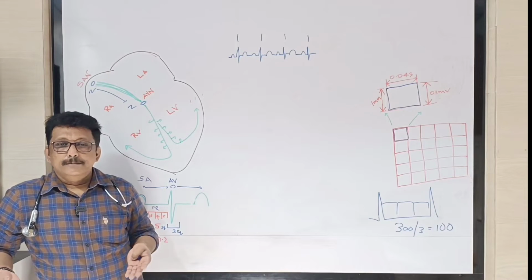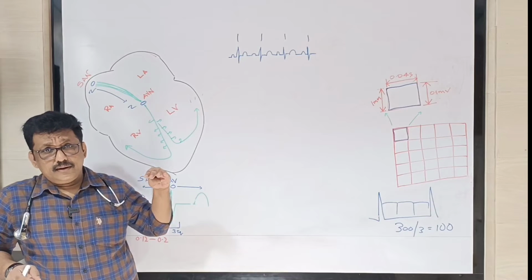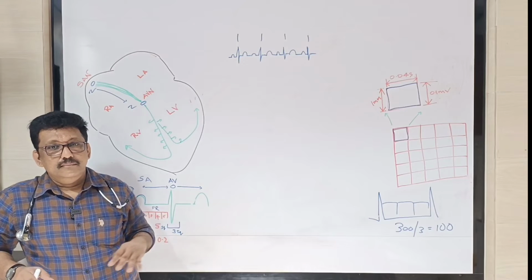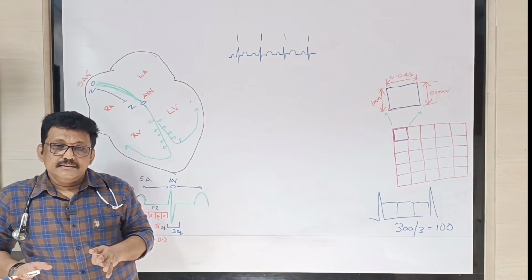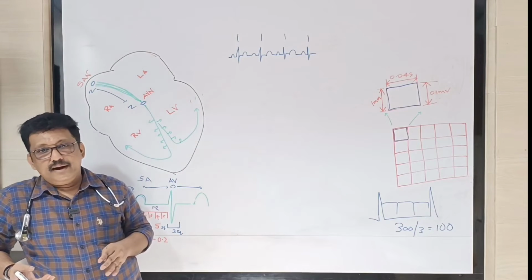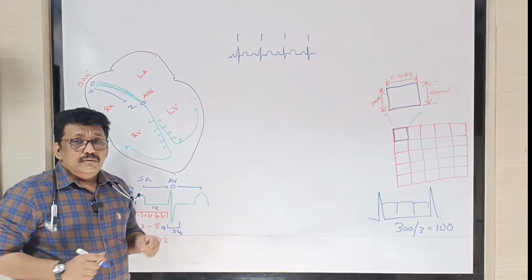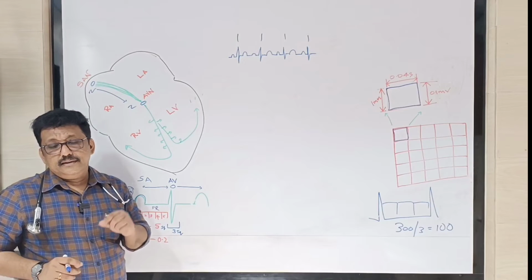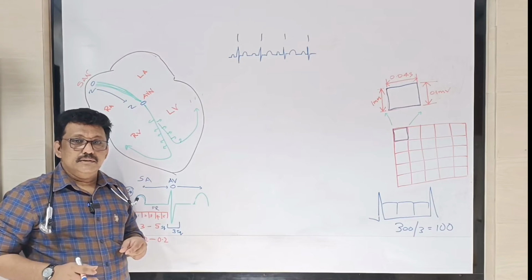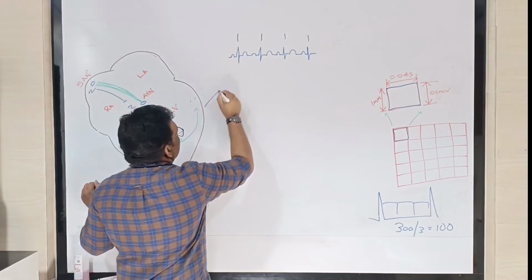There are multiple reasons for bradycardia and tachycardia: cardiac reasons, non-cardiac reasons, and physiological reasons. We are not discussing the reasons here. However, we'll put up a chart where you can see both bradycardia and tachycardia. Now we'll go to different types of tachycardias. That is more important than learning different types of rhythms in ECG. The most important thing will be tachycardias. So we'll see the tachycardia.